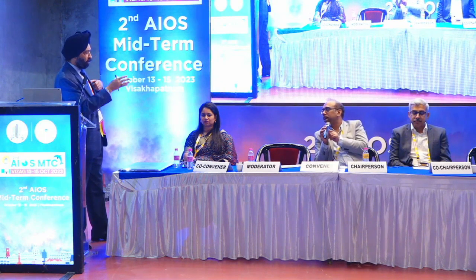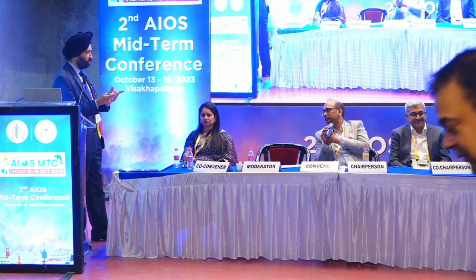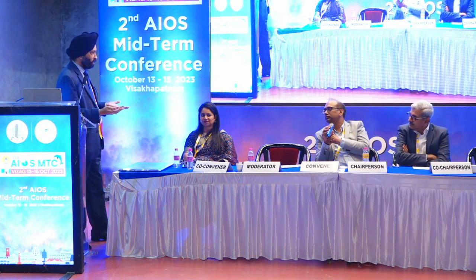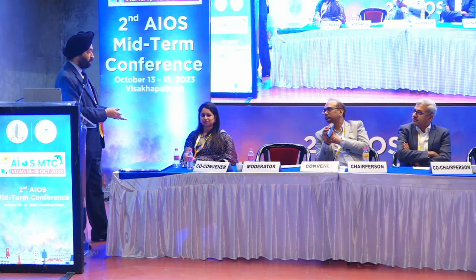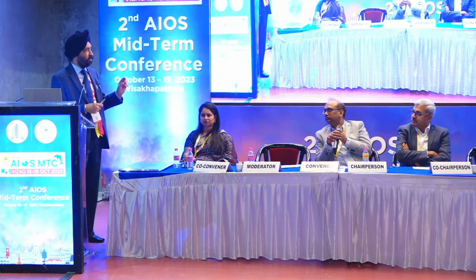So when you are looking at an aspheric lens, it is definitely either zero asphericity or negative asphericity, but making it a positive asphericity, which all these lenses are, they just price it lower. But there are very few post-laser cases where you would want to go in for a positive spherical, otherwise you don't really need it. So that's the thing. They are inducing, but it's only in the central 2 millimeters. Yes. Okay. Thank you.